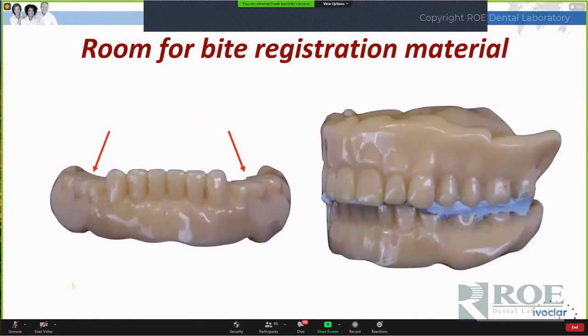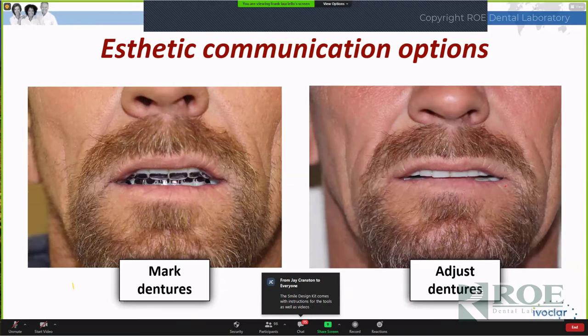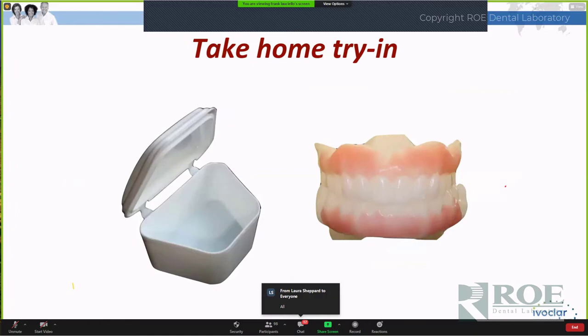A couple of quick tips. What I like about these is that we could grind the lower posteriors to make room for the impression materials. We could do anything you want with these. These are just temporary try-in bases that we could manipulate. We could mark them, in this case with a magic marker, to communicate to the laboratory: I want these teeth shortened, and so on. Or I could grind them like I did on the same patient on the right. I marked it first, and I literally ground the teeth down to where I think they would be better. That's my method of communicating to the laboratory where I want my changes to be. So there's a multitude of ways to make these communications is what I'm trying to get at.